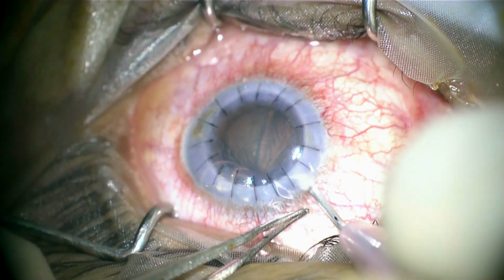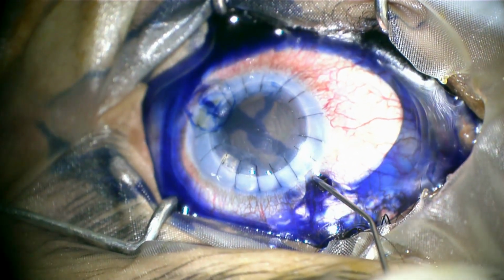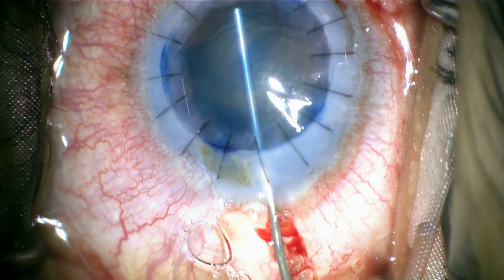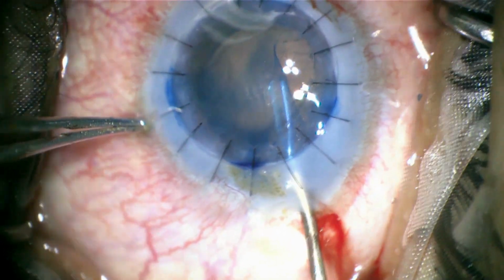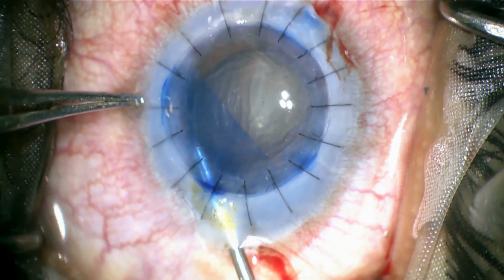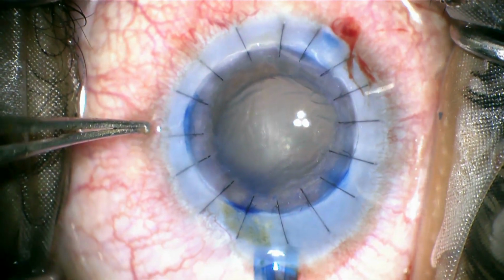A posterior limbal entry was made to avoid entry into the interface, and trypan blue dye was injected to stain the retained host Descemet membrane. OVD was injected through the graft-host junction to form the interface space and push down the retained host Descemet membrane. Descemetorhexis was performed using an ILM peeling forceps from beyond the graft-host junction in a circumferential manner to remove the retained host Descemet membrane without damaging the graft Descemet membrane.